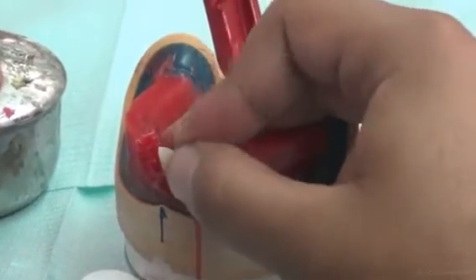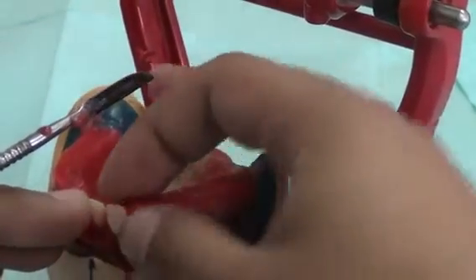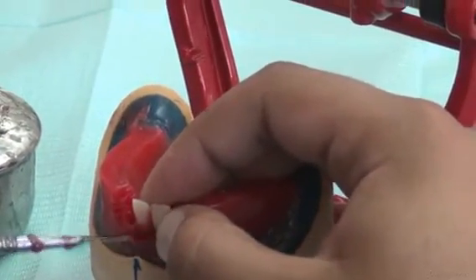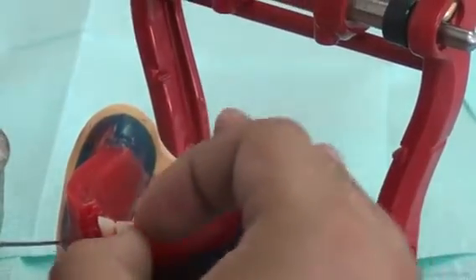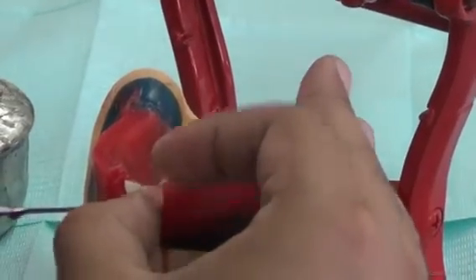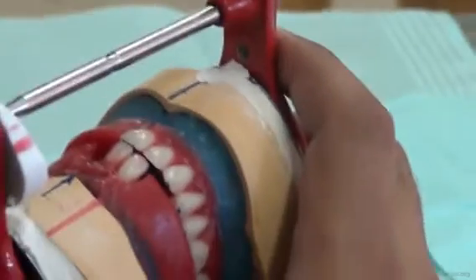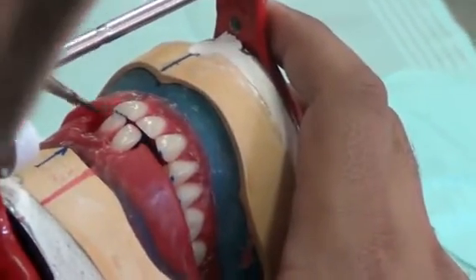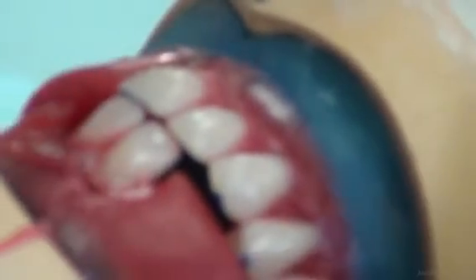Now the lateral incisor, when you set it, you need to set it distally inclined. The root is distally inclined. The root itself is depressed into the wax. The incisal edge is more prominent to produce the labial inclination of the tooth. The tooth should be in contact with the central incisor, and the overbite and the overjet are still applicable. And notice that when you look closely, the overjet should be parallel between both teeth. So the overjet that we have created should be parallel between upper and lower teeth.